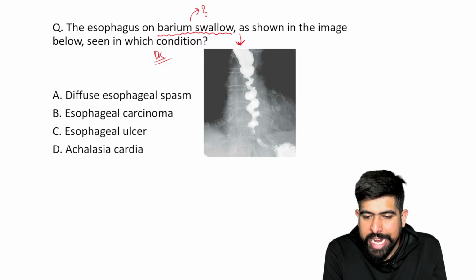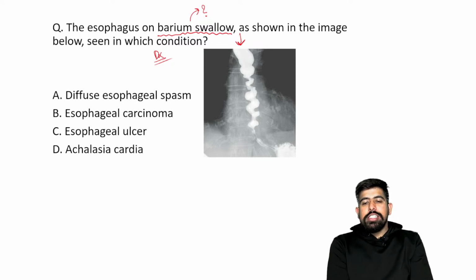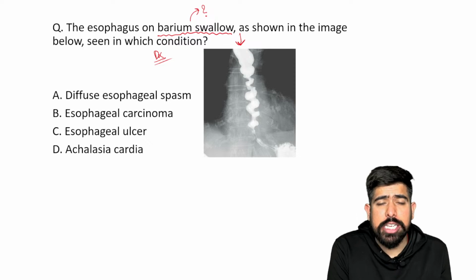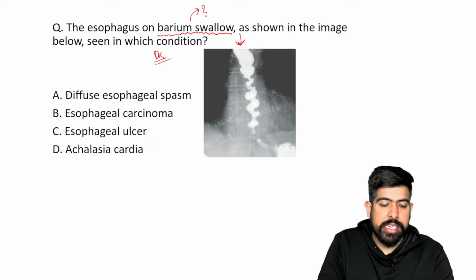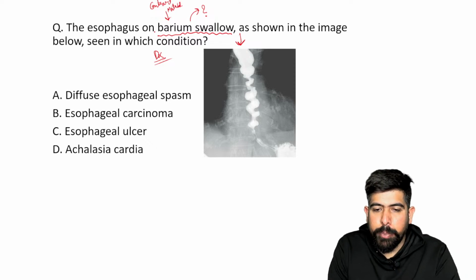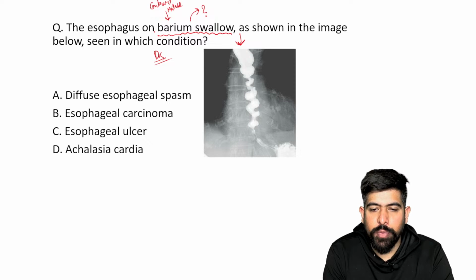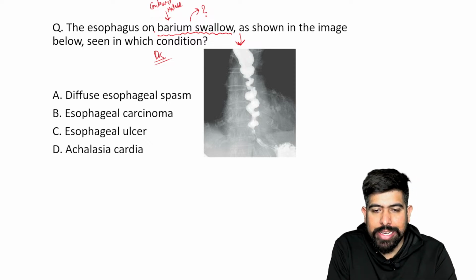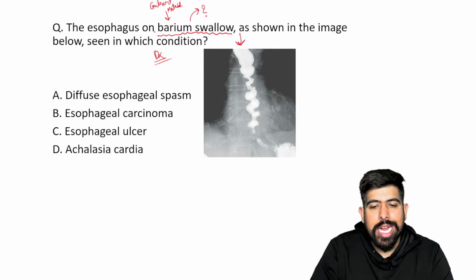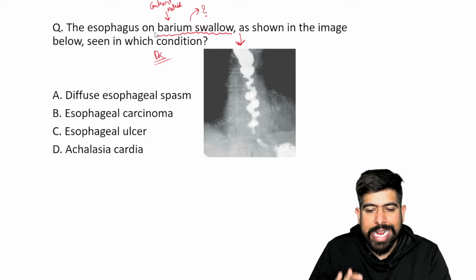So barium swallow is the diagnostic modality for the esophagus. About the motility, we are not going into it, just remember. For esophageal anatomical or any disturbance, we use this. Barium is your contrast material. We give this contrast material to the patient to drink. When the patient swallows the barium, it goes into the esophagus, and then we take the x-ray of this patient.